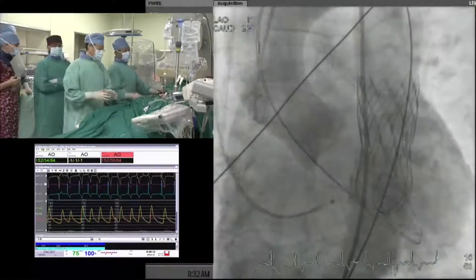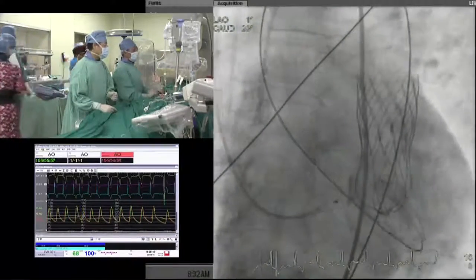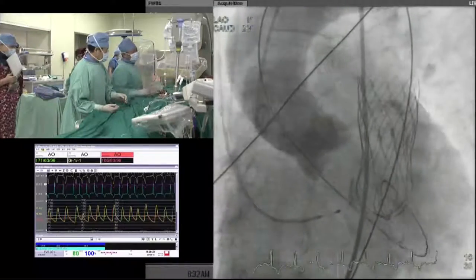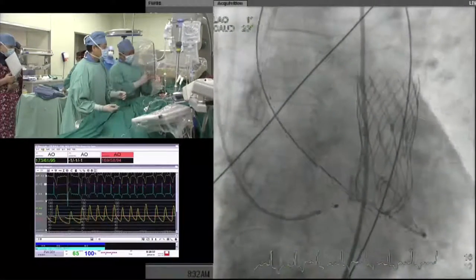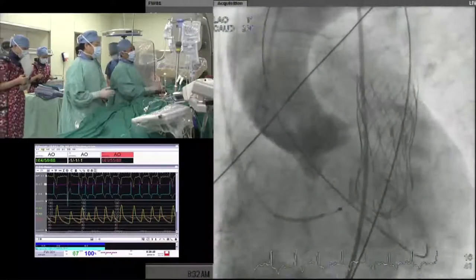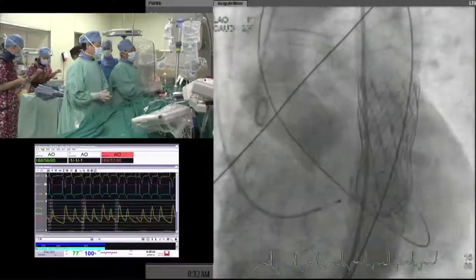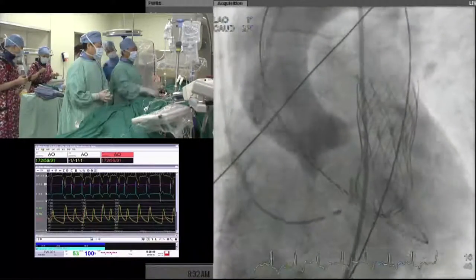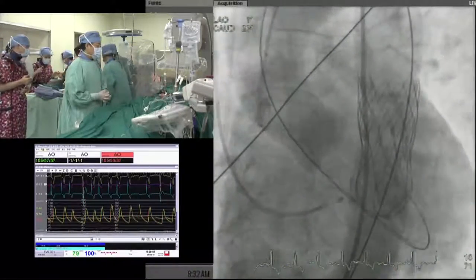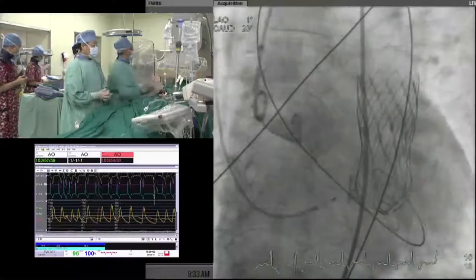I don't quite understand because the valve, I think, was very well dilated. So I would have thought it would have spread the commissures and expanded. I think it's the predilation. The predilation is very, very important because it's not totally open. Uh-huh. So there's no space for the valve. Yeah. Expansion. So the question is, do you go back? Can we downsize? But I think if we continue the TAVR process, we should make a predilation again. How to change it? Do you agree? Should we downsize the valve? No. So I'd wonder about either redilating or perhaps, because this is a new valve, thinking of a more traditional valve. Okay, yeah.